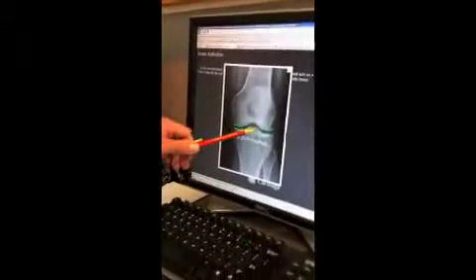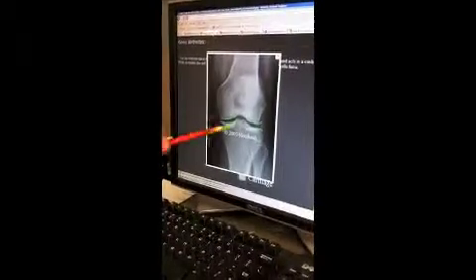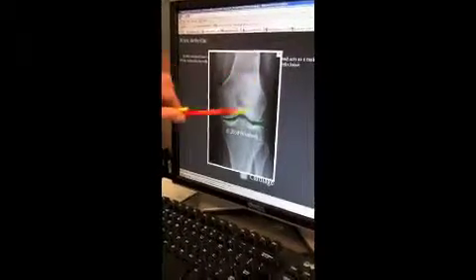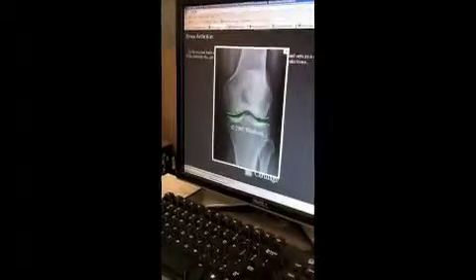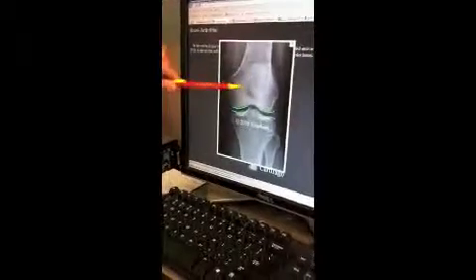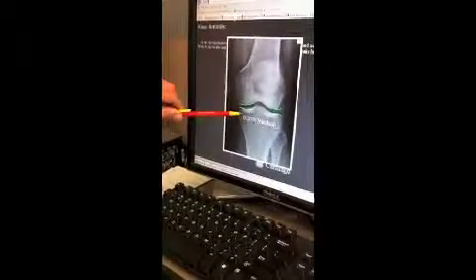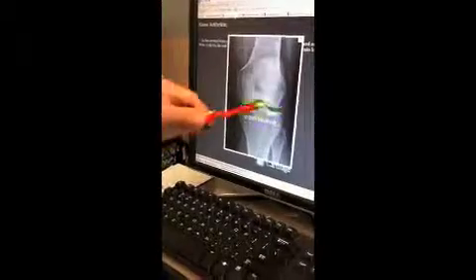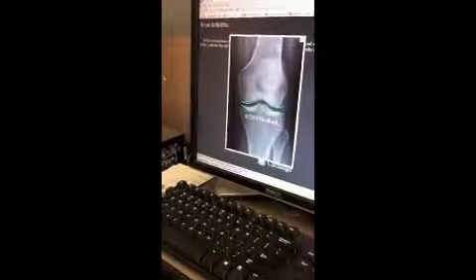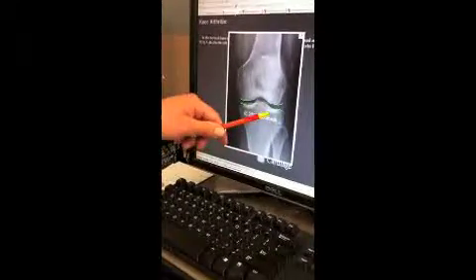For the AP knee, you want open femorotibial joint space with interspaces of equal width on both sides if the knee is normal. You want the patella superimposed on the femur. No rotation of the femur. You want the femoral condyles to be roughly symmetric. And you also want no rotation of the tibia. You want the intercondylar eminence centered. And you want a slight superimposition of the fibular head on the proximal tibia.